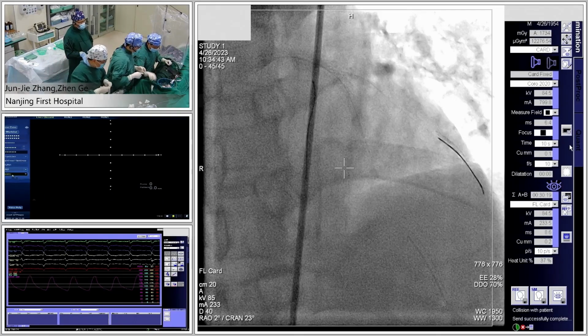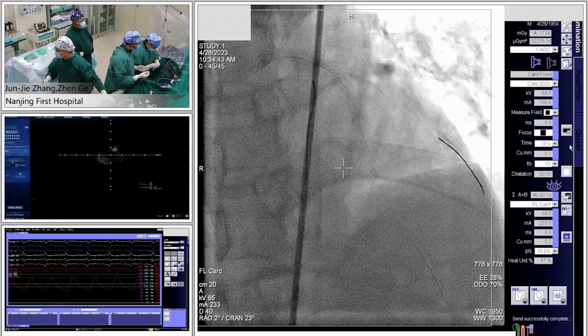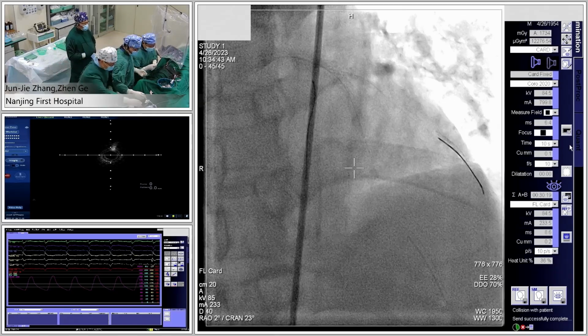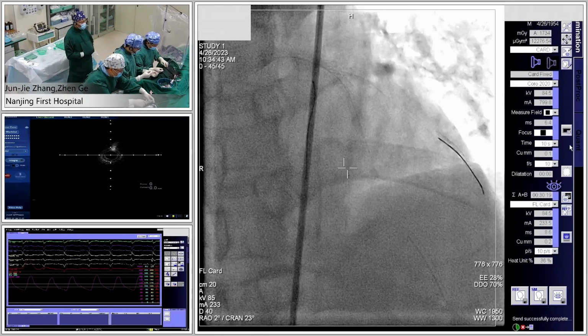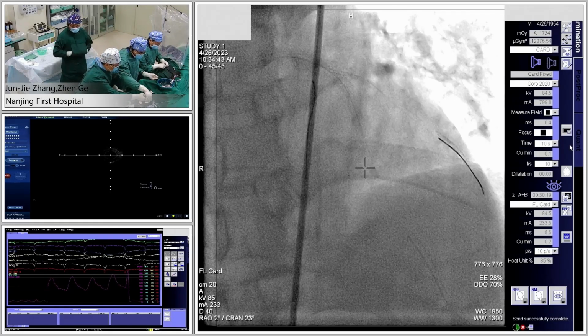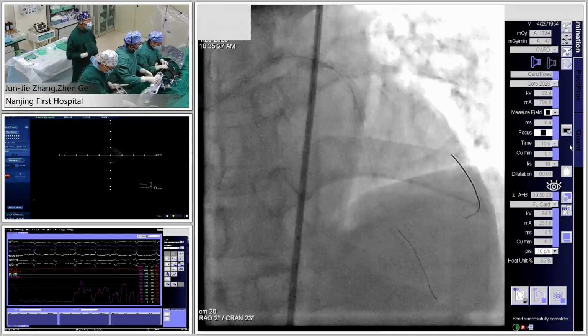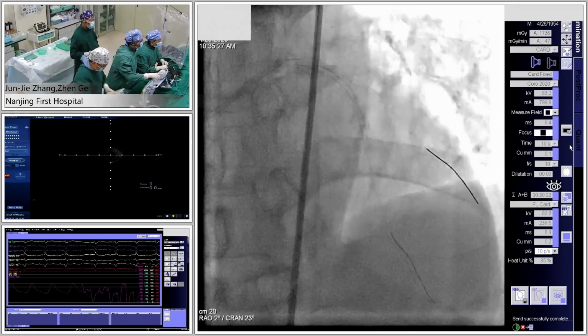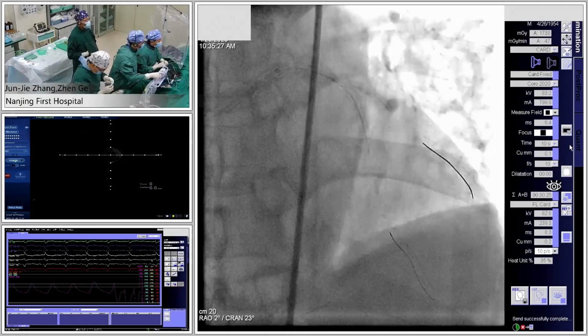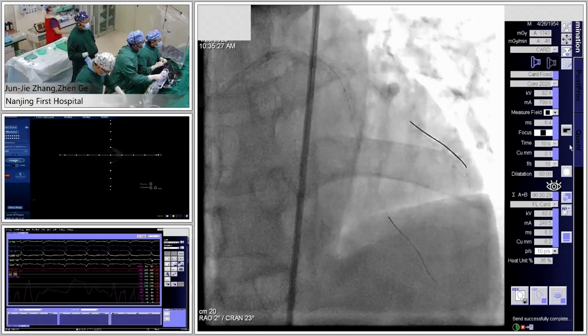So this is very important. We'll check the IVUS to confirm the side branch rewiring is from the proximal cell. Be careful of the distal wire tip. So at this time, we insert the IVUS catheter into the main vessel and auto pull back.